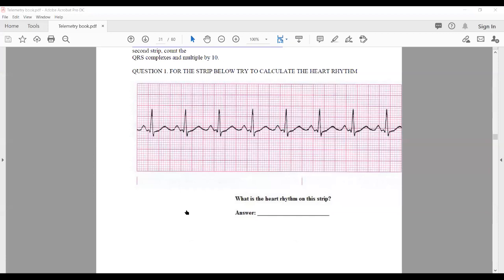So these are screen calipers. Let's look at the atrial rhythm and the ventricular rhythm, shall we? We're going to line up, always horizontal, from the peak of the one P to the peak of the other P. This should be equidistant between each of the P's. So P to P, this is regular. P to P, pretty close. P to P, P to P, P to P, P to P, and P to P. So what can we say about our atrial rhythm? It's regularly regular. So far, so good, right? Our heart rate is not abnormal, it's 100. It's right on the cusp of being tachycardic because anything above 100 beats per minute is tachycardia, but it's not, so it's still considered a normal range.